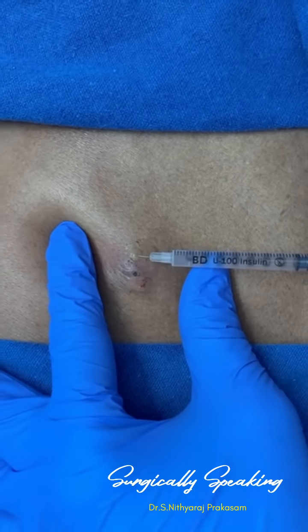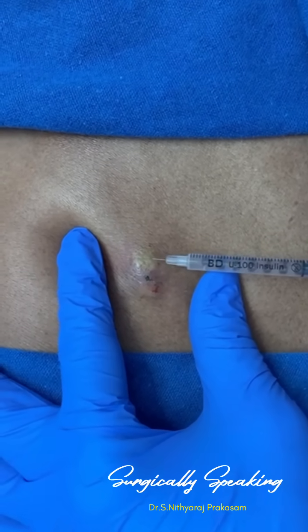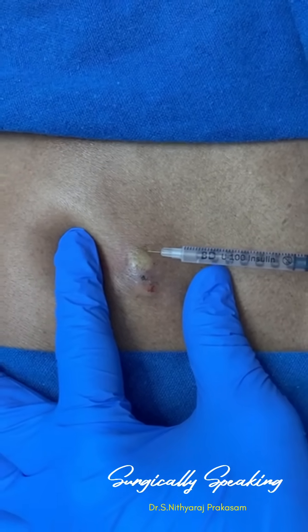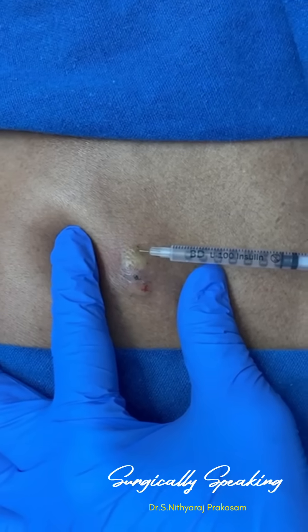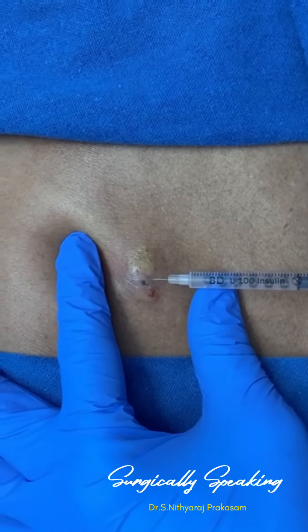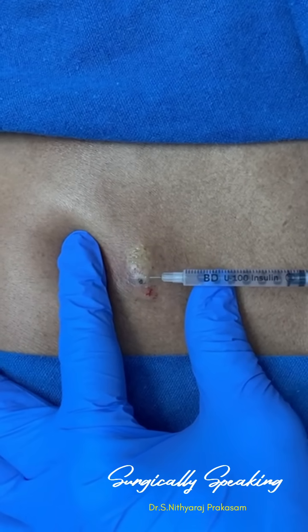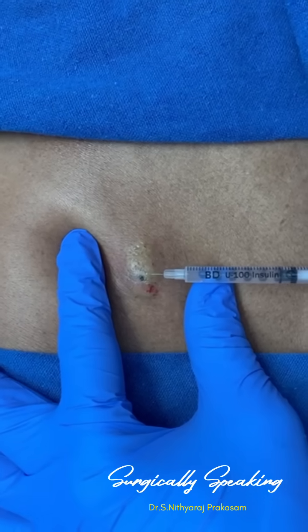You can see my patient is tolerating the injection very well. This is going to be injected only in the proposed line of incision, because my aim is only to do an incision and drainage. I am not going to unnecessarily push a lot of local anesthesia there.